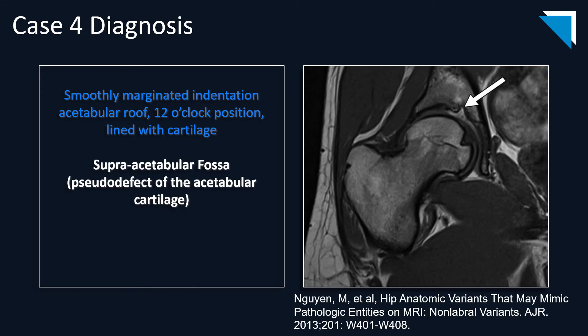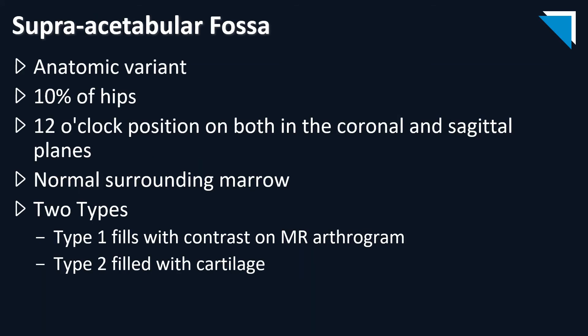The diagnosis is a normal anatomic variant that can mimic pathological etiologies. This is called a supra-acetabular fossa, otherwise known as a pseudo-defect of the acetabular cartilage. It is smoothly marginated in the acetabular roof at the 12 o'clock position, lined with cartilage. It is present in 10% of hips and should be seen at the 12 o'clock position in both coronal and sagittal planes. There are two types: one that fills with contrast and one filled with cartilage.